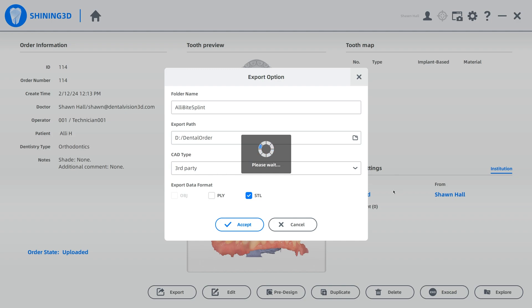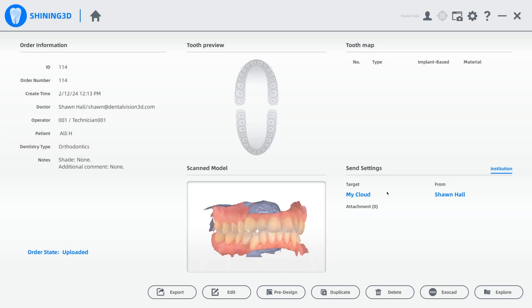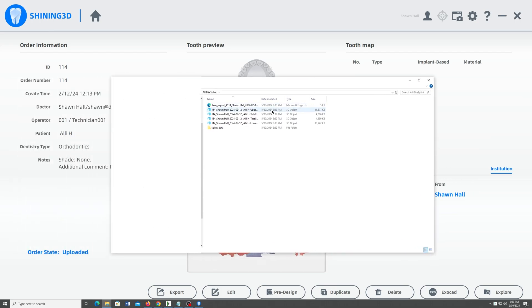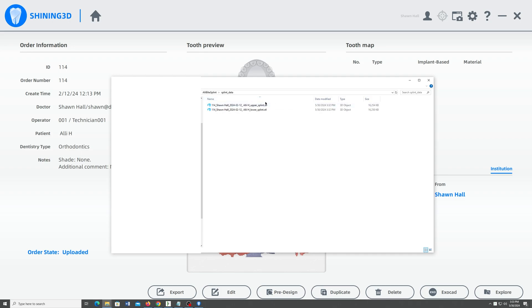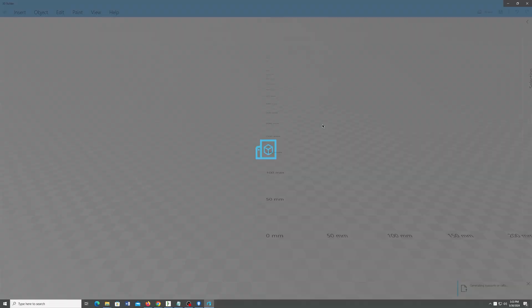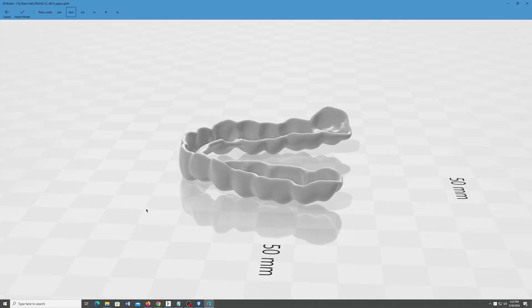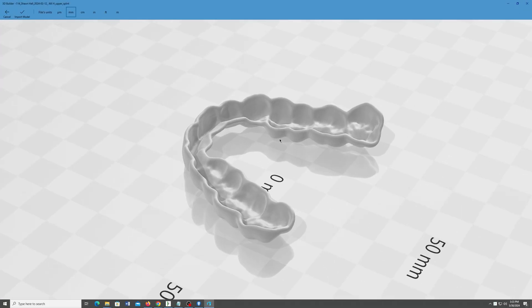When you do an export, it'll also pop open the folder that it just sent all the files to, which is pretty convenient for being able to find them or drop them onto a thumb drive if you've got to walk it over to another computer. So you can see it popped open this folder. So what I would do is click on Splint Data there. This file right here is what you'd want to drop on a thumb drive or put on your network drive and take over to the computer that has your 3D printer software on it and just drop this Splint into the software the same way it did automatically. You can see, there it is. There's the Splint.